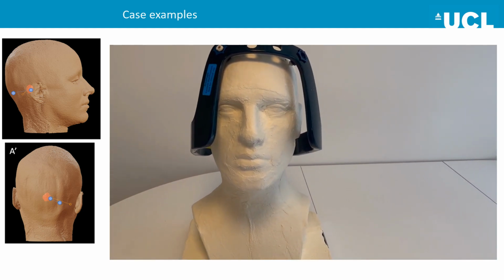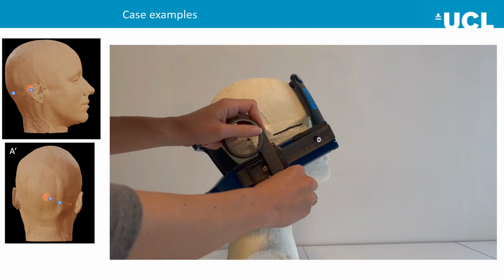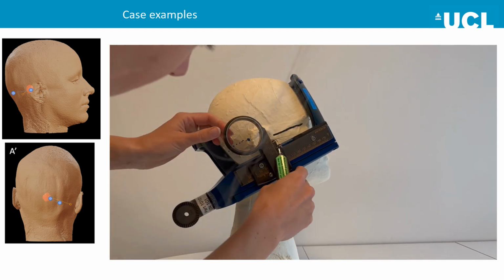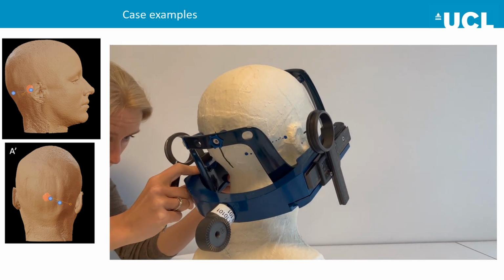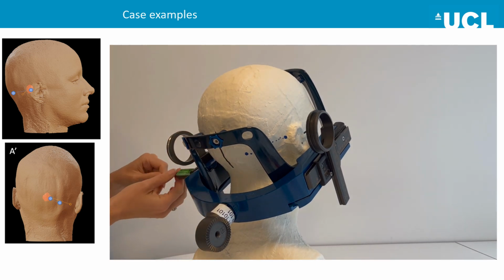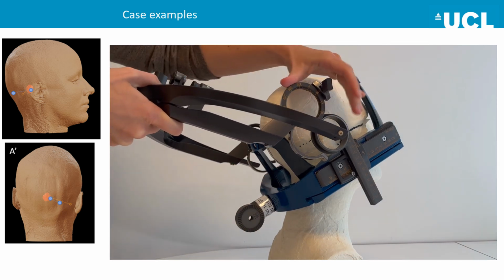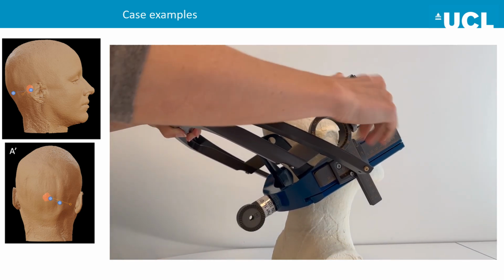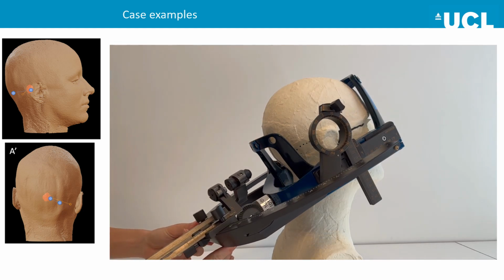You can also see how I rotated the frame so that the entry point is at least 2 centimeters away from the side poles and the upper poles. And now I attach the Y and the Z. So now when we place our arc system with a lateral right approach, we can see that it'll just work because it's almost parallel. So this is a feasible trajectory now.